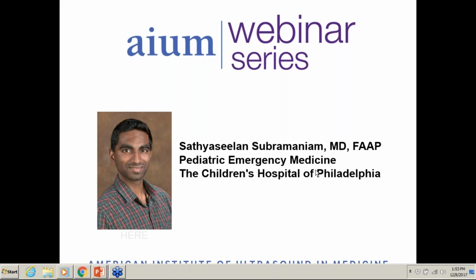I've seen Adam Sivitz. He and I scanned once, and I learned a lot from him. He showed me a method where you could use the linear transducer and slide it. Instead of having your probe anterior to the right lower quadrant, you're sliding your probe to a lateral position, and your beam is pointing right into the psoas muscle area. It's a lateral posterior approach, and that's one way of getting the retrocecal appendix.